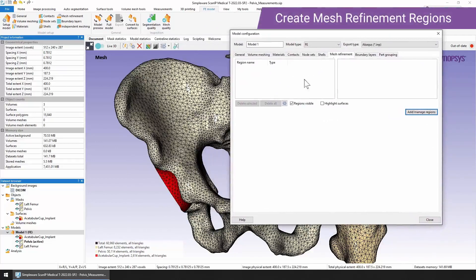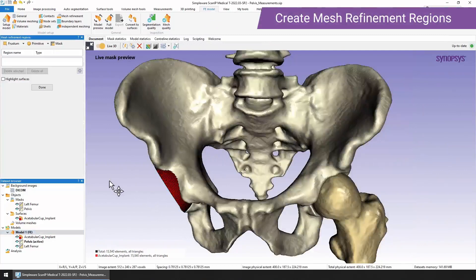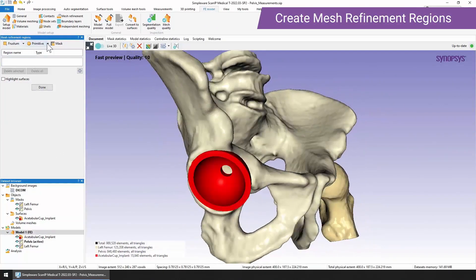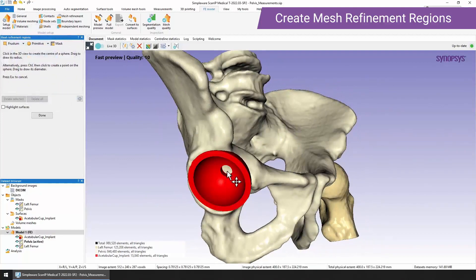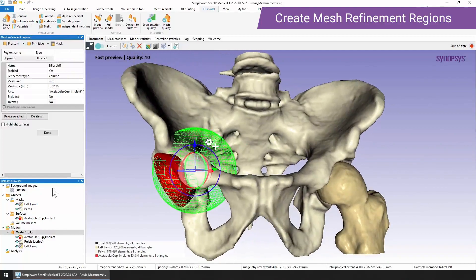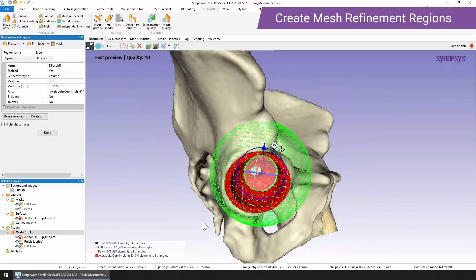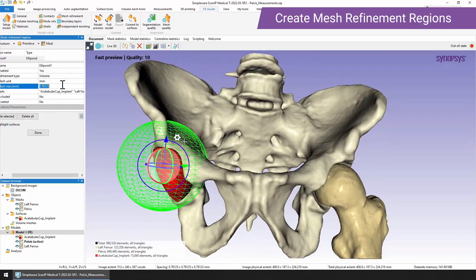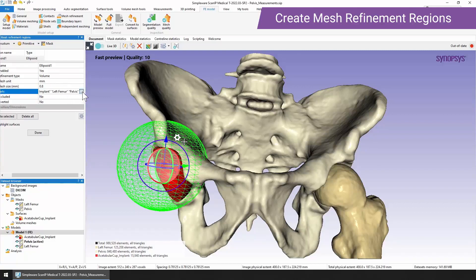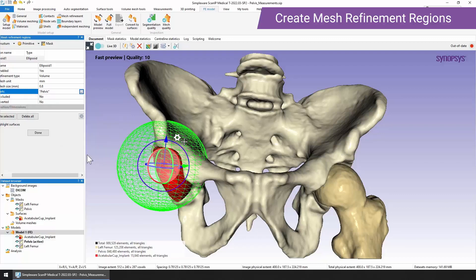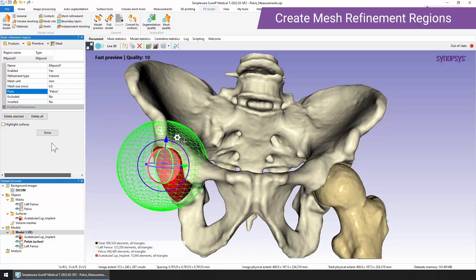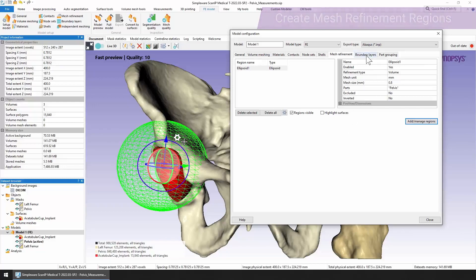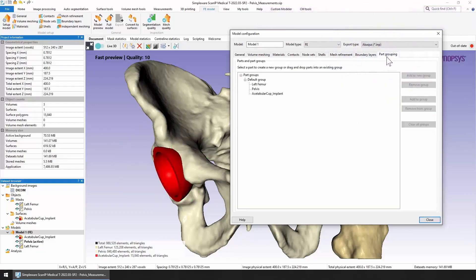These are all added in the same way. You just click add and manage regions. You just create a region of interest that you want to use. Here I'm just using a sphere and I'm just going to place this in the position that I want it to be in. So I've selected this region around the acetabular cup that I'd like to use. And then I just select what size of mesh I would like to use here. So I'm going to use 0.8. And then we can select the parts that we'd like this to operate on. In this case, I'm just going to choose the pelvis. Once we're happy with our selection, we just click done. And that will be added into your model configuration. You can also set up boundary layers or part grouping, as I spoke about before. So once you're ready, you just click close. All the settings are there, and then you can just click full model.